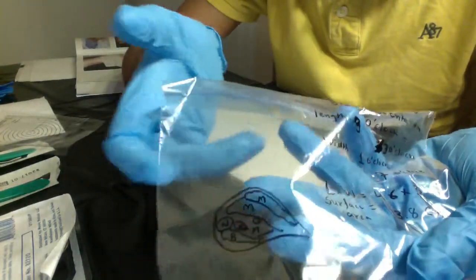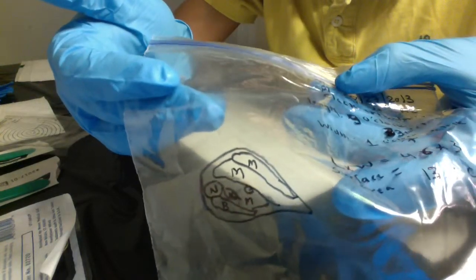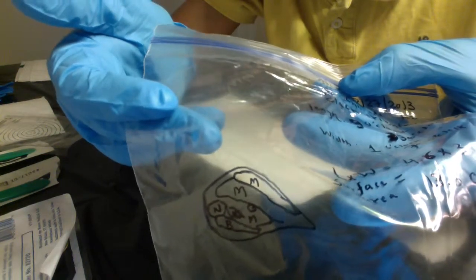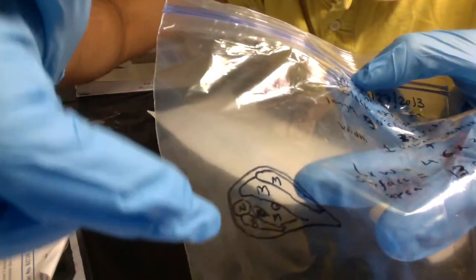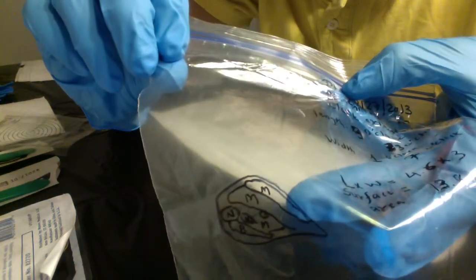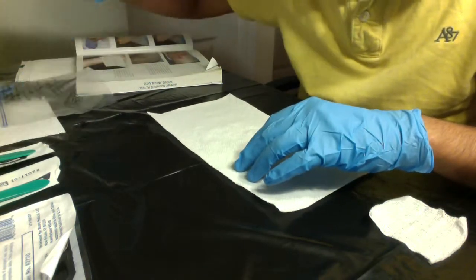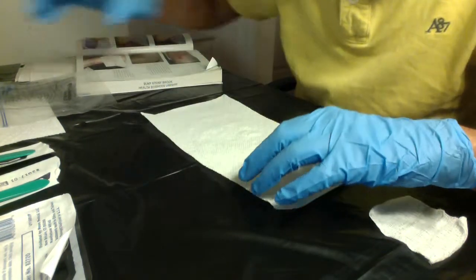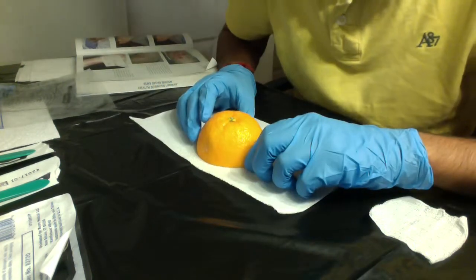In addition to that, I've also marked the wound markings. That is, M stands for muscles, N stands for necrotic tissue, B stands for bone, and this is the margin of the wound. I took this picture from the textbook, as I mentioned. So this was the wound tracing and surface marking. Now I would start with shaving and paring process.